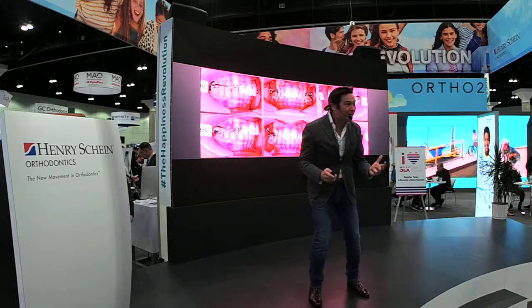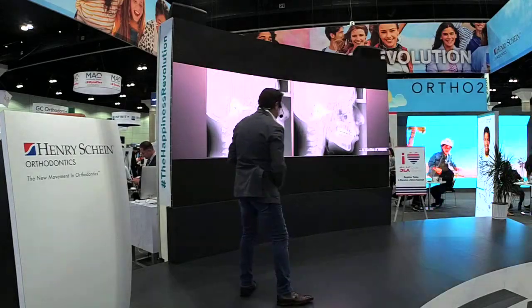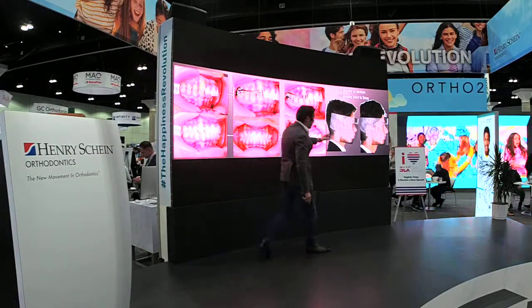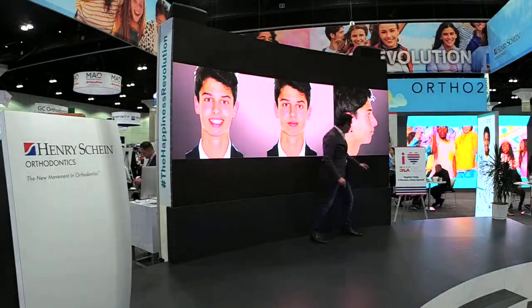So this is what we need to convert a scenario into one in which we are able to solve with braces or with aligners. So this is what we do. So 5 months later, we accomplish it. So now we can end this treatment. But look at the difference. The mandible has been brought forward. This is a scenario of occlusion, and the most important thing, a good relation.